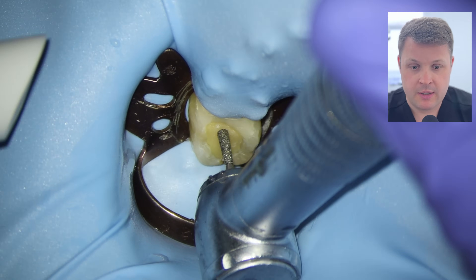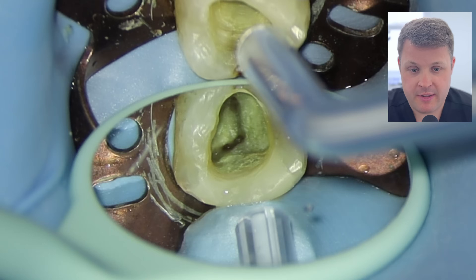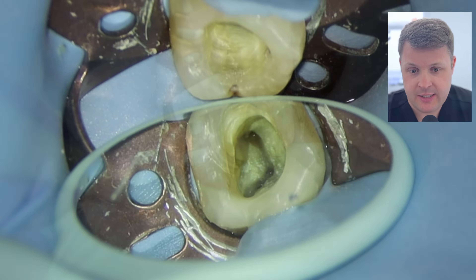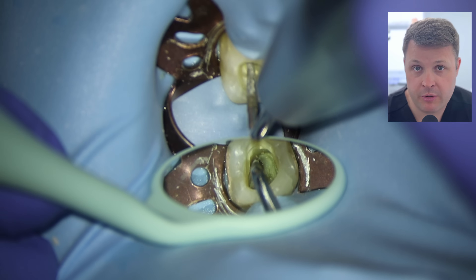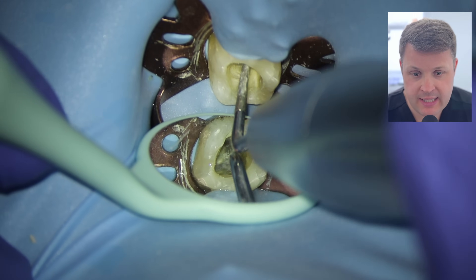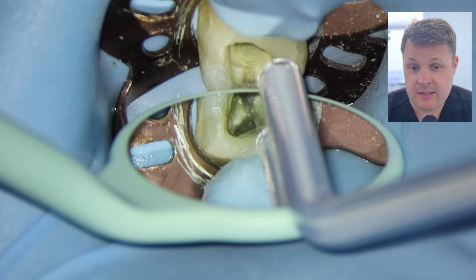The first and most important part is to remove the dressing — it's been dressed with a cotton wool pellet. Once we remove everything, we can see the access cavity looks a bit unusual. We haven't got the symmetry we usually get at the base of the cavity; this could be due to tertiary dentin or unusual canal anatomy. We need to refine the coronal third before we start shaping. I'm using diamond-tipped ultrasonics to clear up the distal aspect of this tooth.